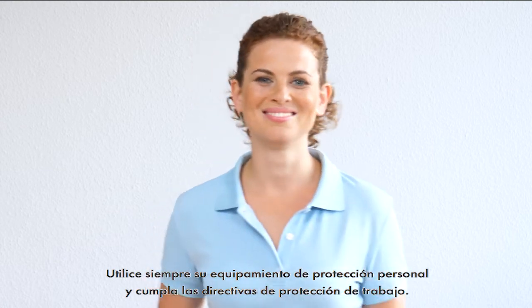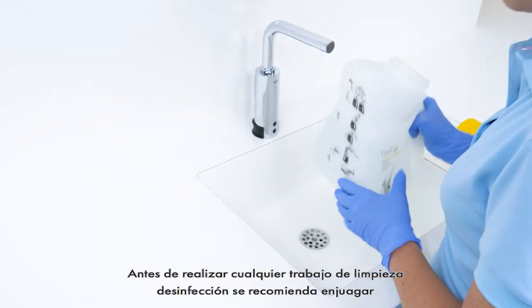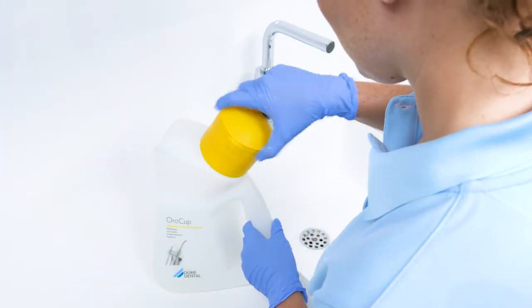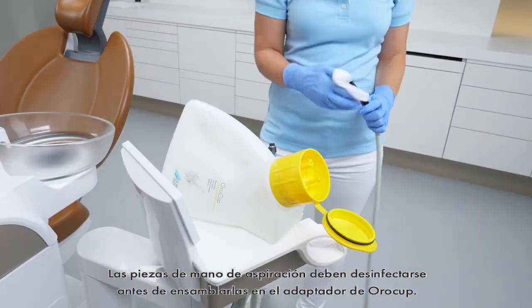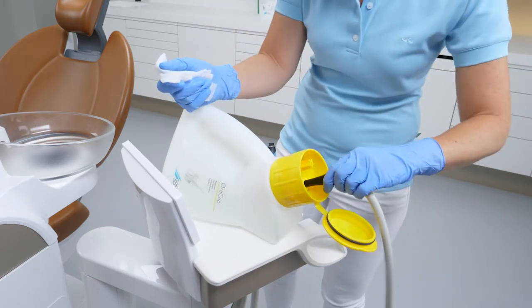Please wear personal protective equipment and observe the occupational safety directives. We recommend rinsing the suction system with 2 litres of cold water prior to every cleaning or disinfection process. Disinfect the suction handpieces before you connect them to the adapters of the OroCups. The rinsing removes coarse particles from the system.